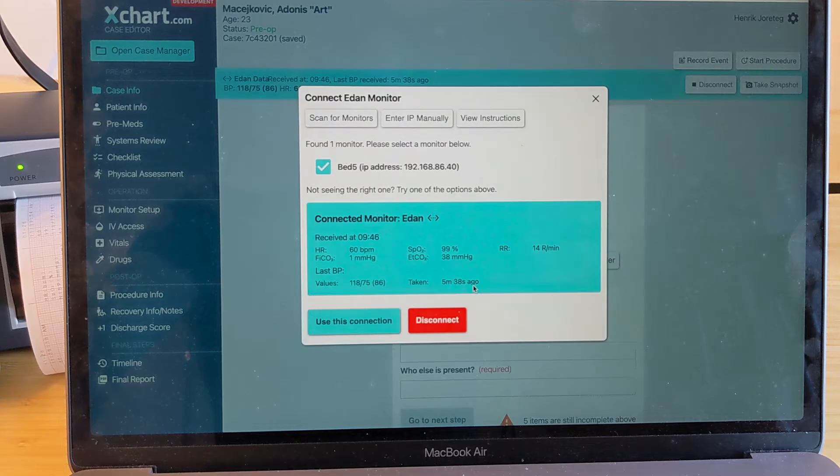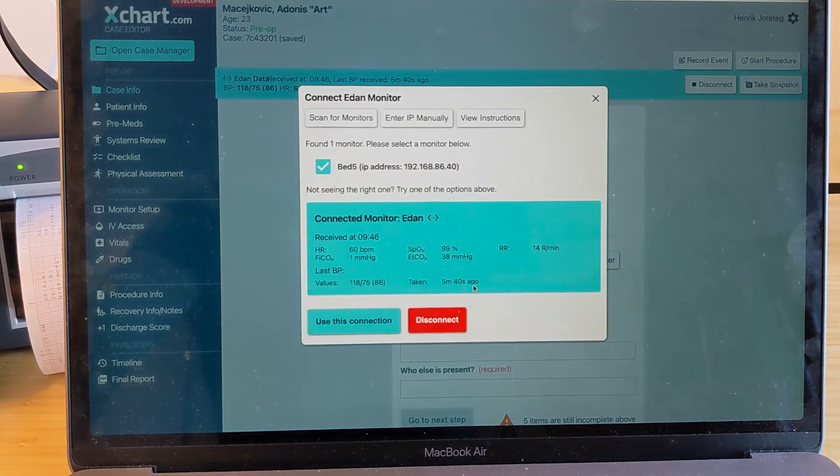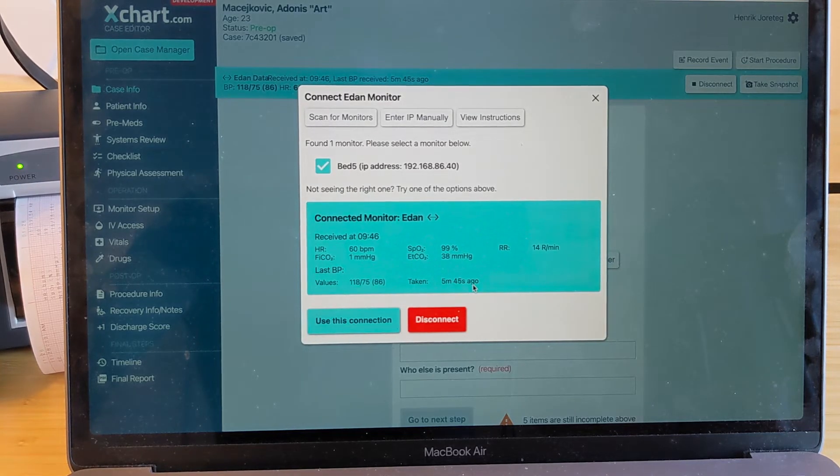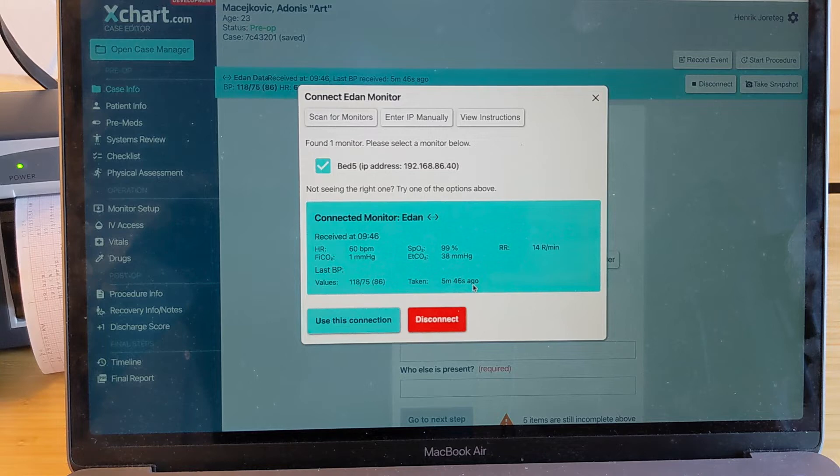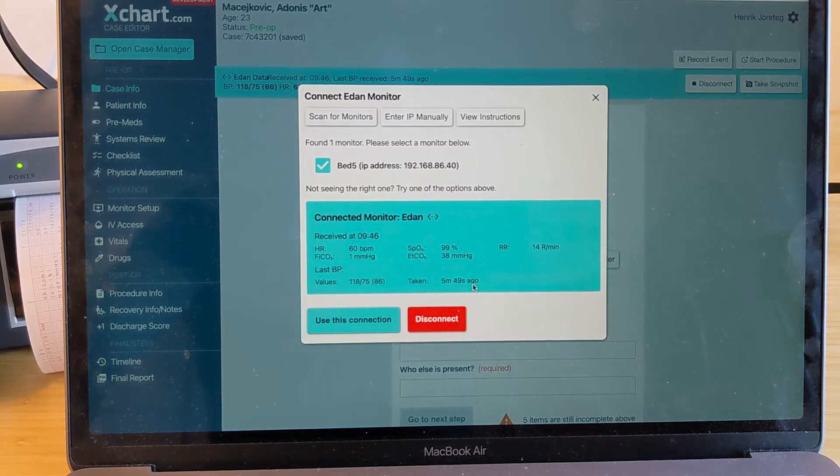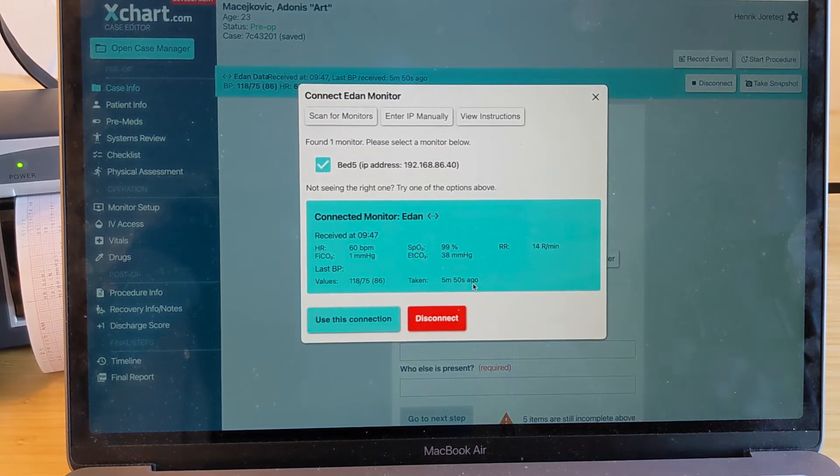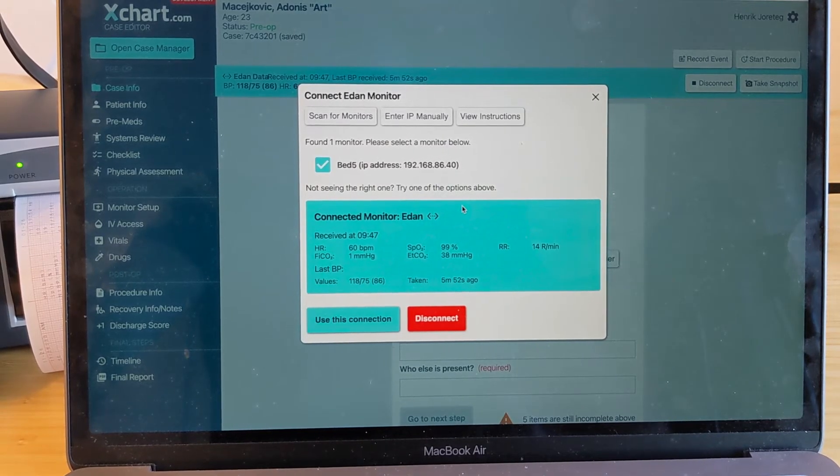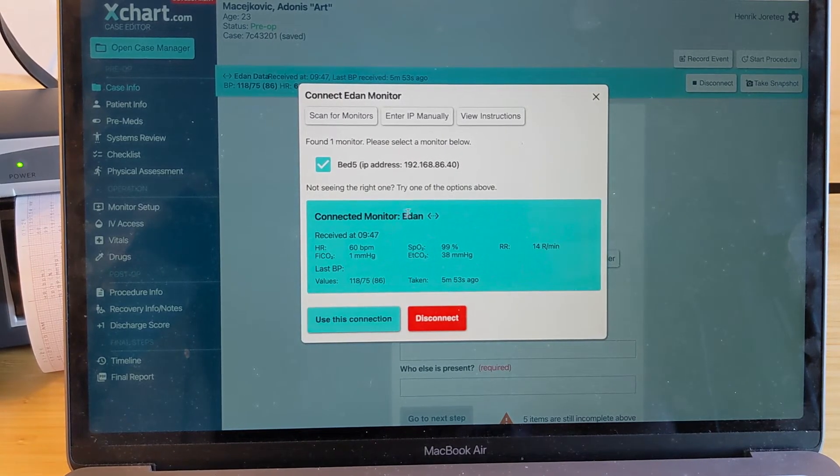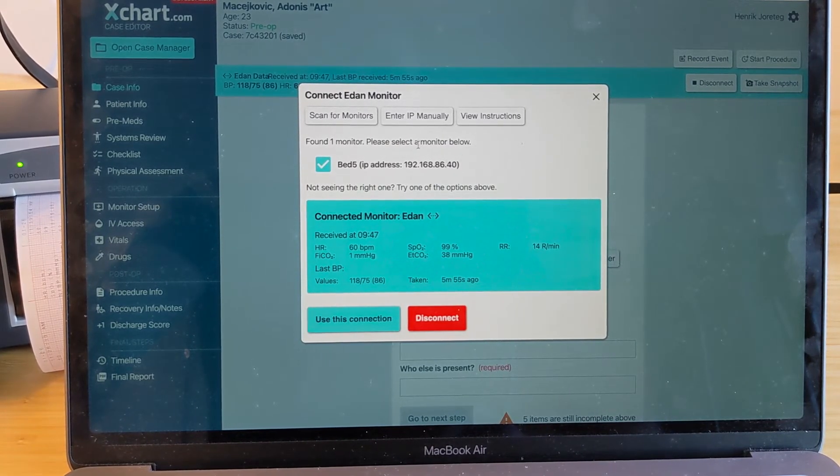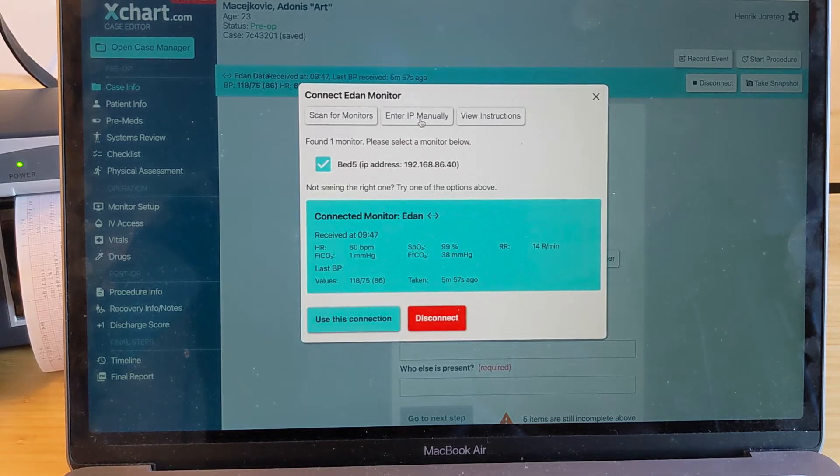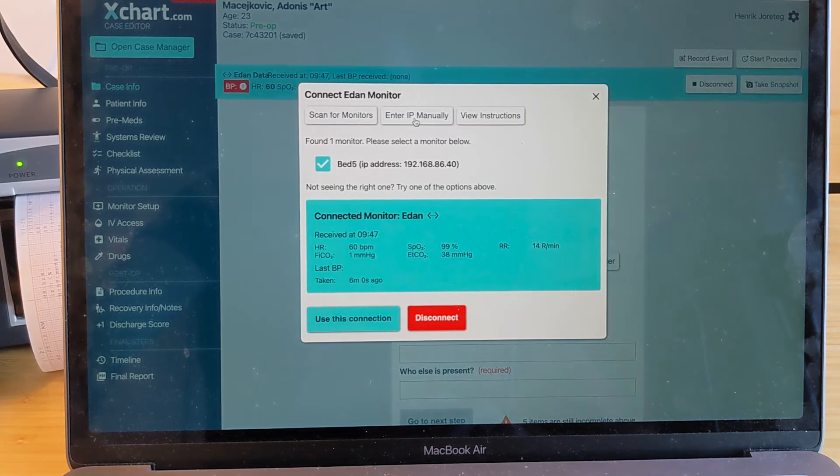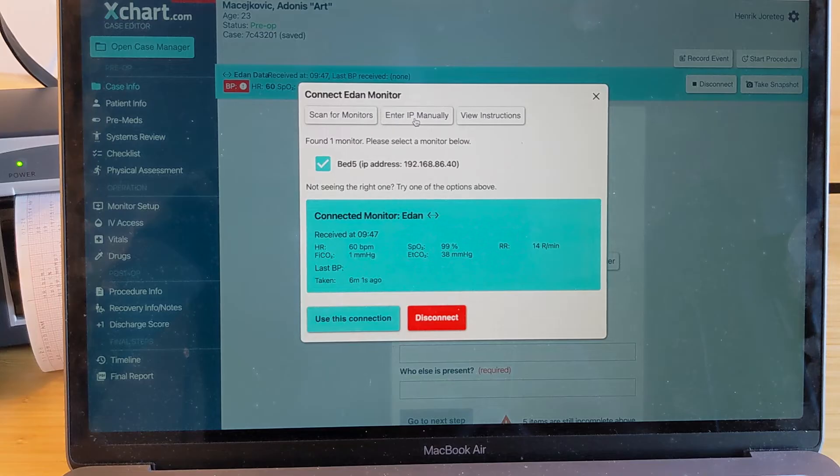So this depends a little bit on how your network is set up. Some of them are kind of obfuscated, so it's a little more difficult for it to search on the network. But in this particular case, it found it just fine. And if for whatever reason it does not find it, it will show you an error message. And then you can choose to enter the IP address manually, which is what I showed you before.